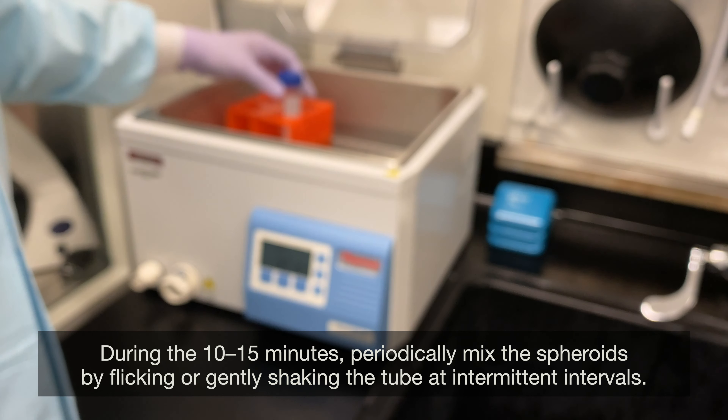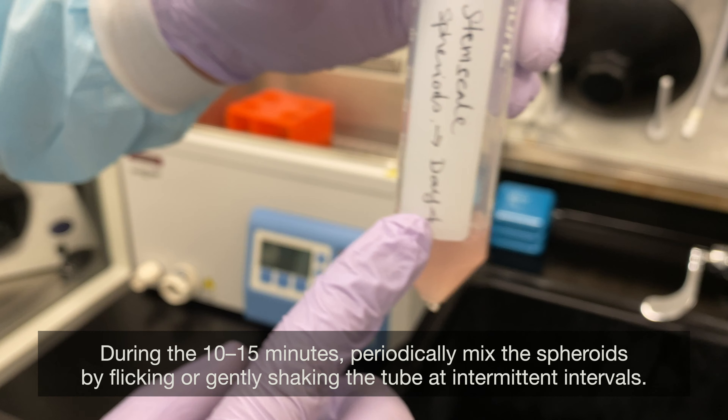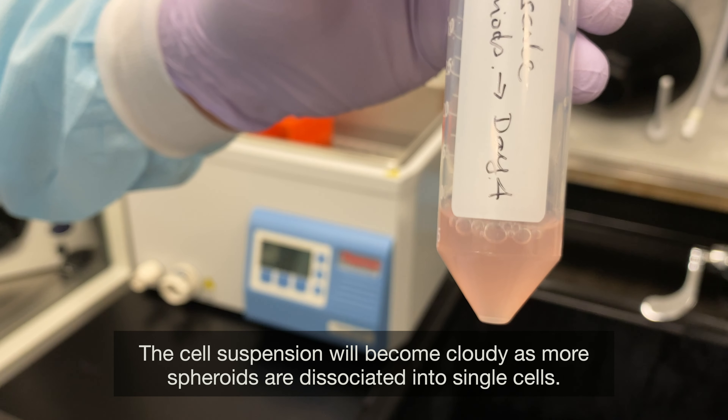During the 10 to 15 minutes, periodically mix the spheroids by flicking or gently shaking the tube at intermittent intervals. The cell suspension will become cloudy as more spheroids are dissociated into single cells.